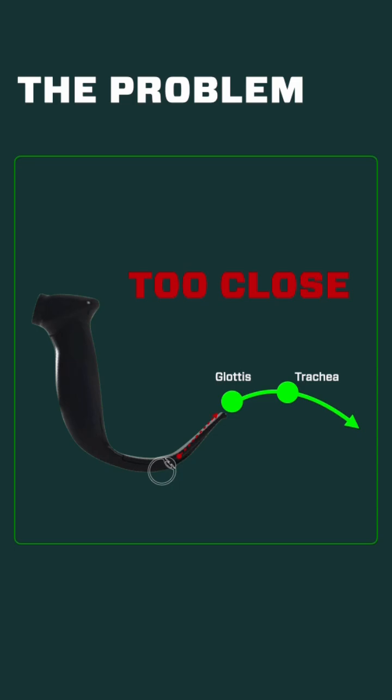The most common problem and difficulty that people have is that they just insert the blade too deep and they're too close to the glottic opening. They get this great view of the glottis that fills the screen, but then they try to deliver that tube and they don't have enough of a pathway — there's not enough room — and then when it arrives it's kind of banging up against the anterior tracheal rings. That's really just an alignment problem and it's an easy fix.